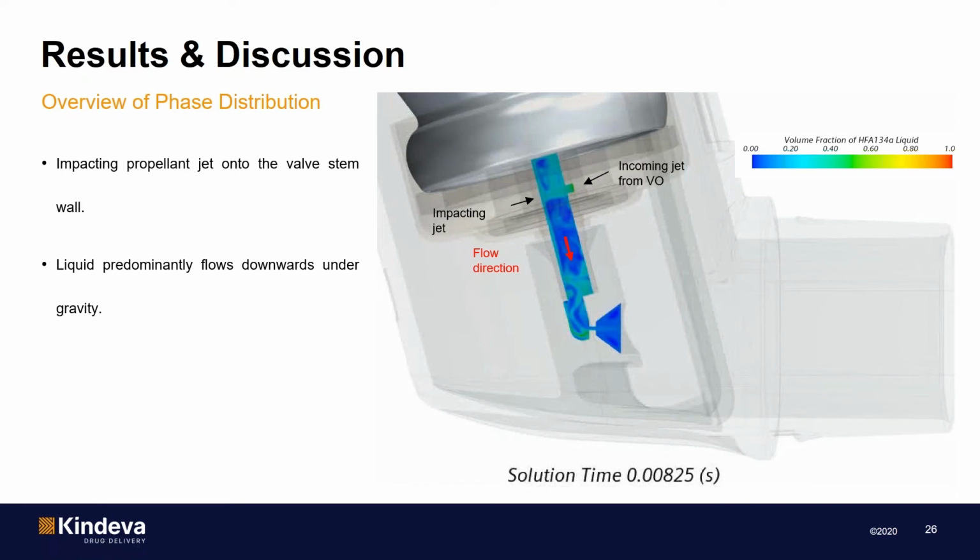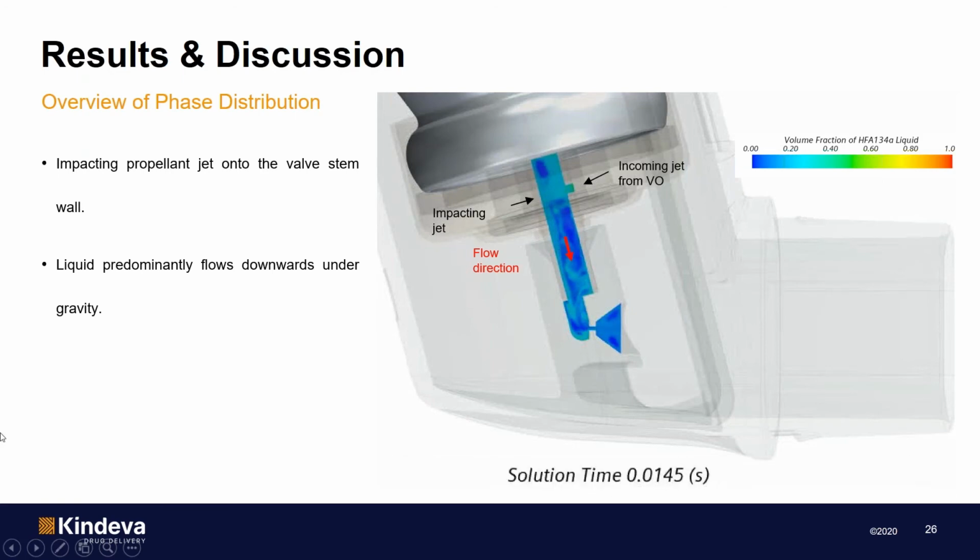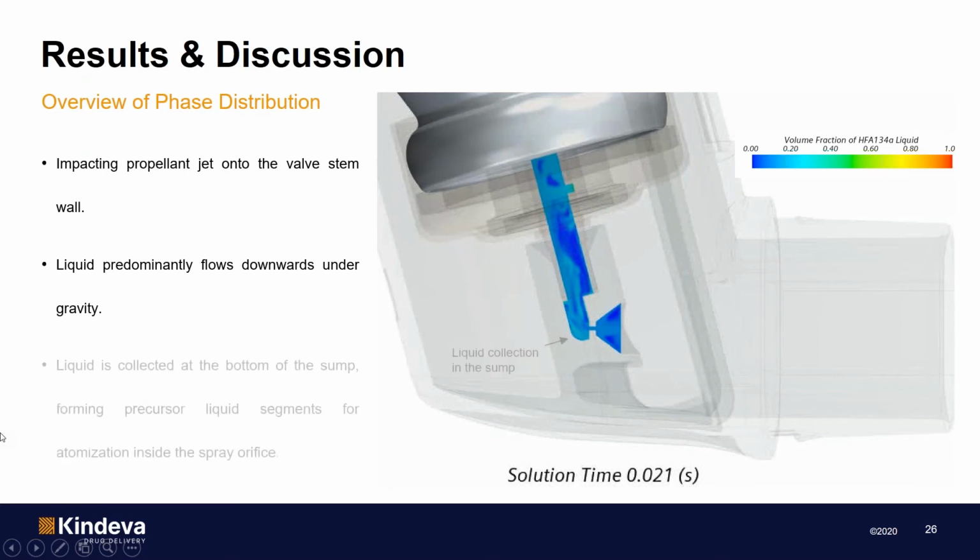And subsequently, the liquid phase predominantly sticks to the wall. The predictions show that much of the liquid also flows downwards under gravity, but some of the liquid has also got sufficient energy to flow upwards first towards the top of the valve stem, and some of it reaches the wall containing the valve orifice. So again, moving forward, you can see that the vapor mainly flows through the central region of the expansion chamber and it forms a vapor-rich core.